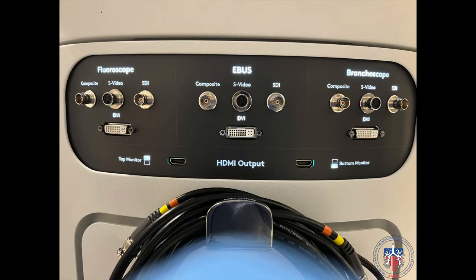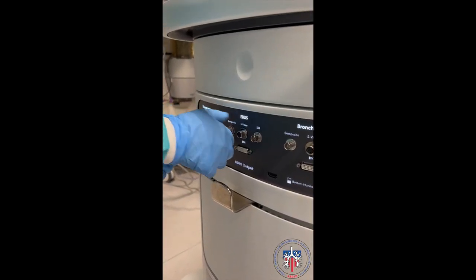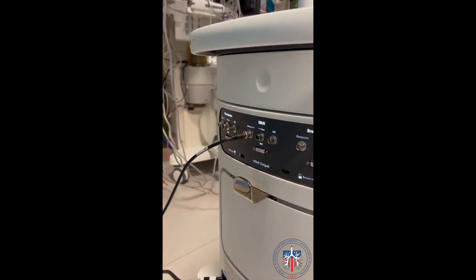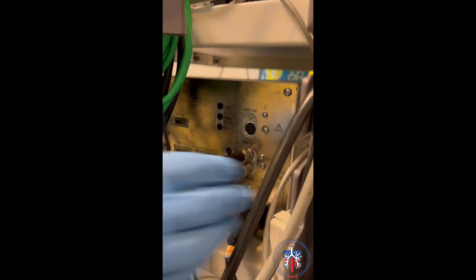Feed connectors are provided at the back of the robotic console. First, a cable connection is made from the robot to the Olympus processor. This allows for visualization of radial probe EBUS images on the robotic monitor.